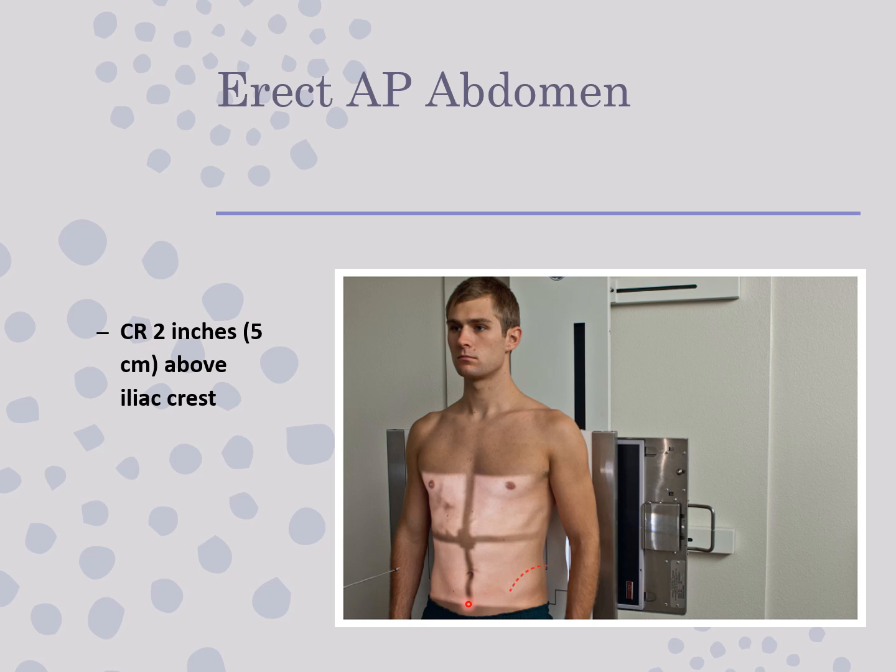They do reference that typically on a sthenic patient, if this patient was to bring his arm out straight, the top of the IR would be right at about the level of the top of his axilla. And that's a valid point. Typically, if you are at the axilla, you are going to definitely get diaphragm, because remember, the light is deceiving. This image is actually going to capture from right up here all the way down here, right?